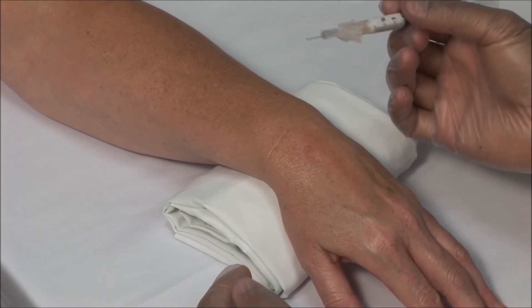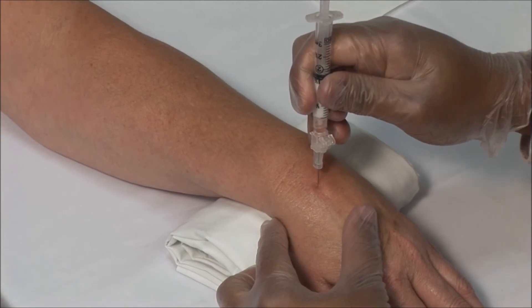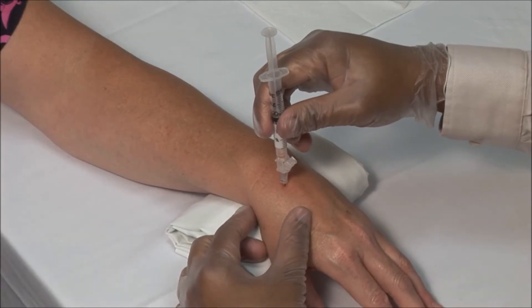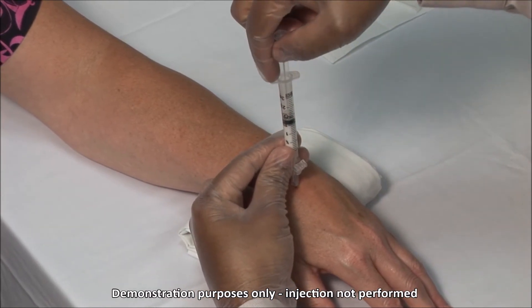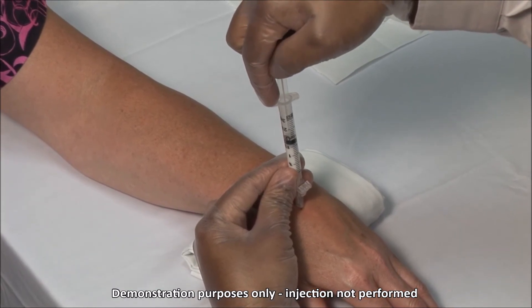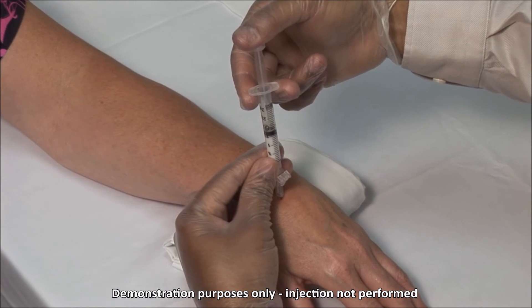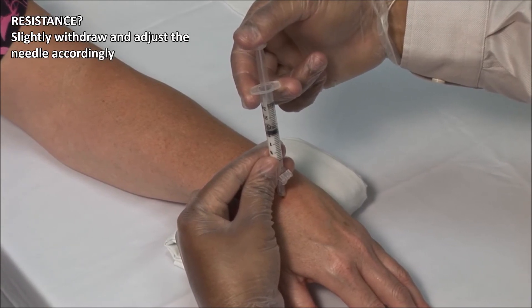Advance the needle perpendicular to the radius to a depth of about 2 cm. You should feel the needle breaching the joint capsule. Aspirate to ensure that you are not in a blood vessel, and then inject the solution. It should go in freely. If there is resistance, slightly withdraw and adjust the needle accordingly.